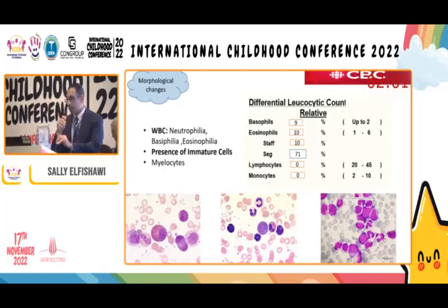Okay, that's another good example. Clinically, in a case like this, with myeloproliferative disorders, the patient comes with a big spleen. The patient most probably is in a very good general condition. Most myeloproliferative disorders present in a good general condition. So this patient has very high leukocytosis, and I can think of leukemia right away. Despite this, what type of leukemia? Is it an acute form or a chronic form?